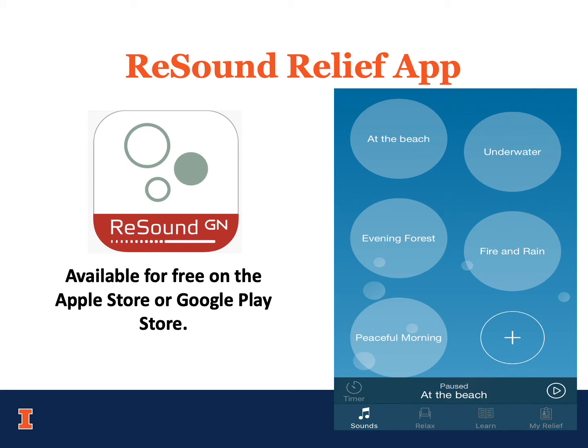To start, we have the ReSound Relief app by ReSound, which is available for free on the Apple Store or the Google Play Store. You do not need hearing aids to be able to use this app, however it is compatible with some of the ReSound hearing aids. On the right-hand side, you can see one of the main screens for the app. Right now, they have 5 soundscapes already added.